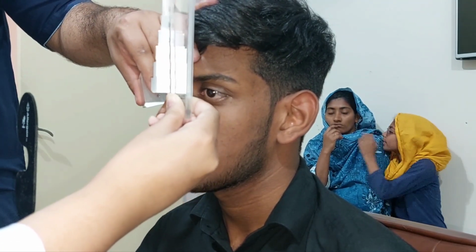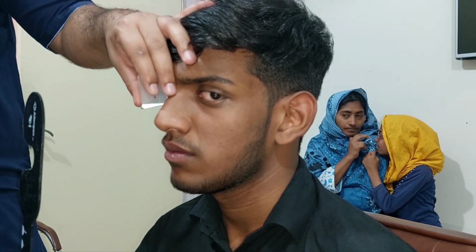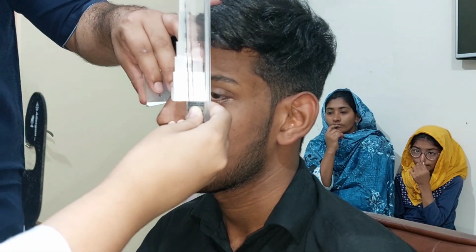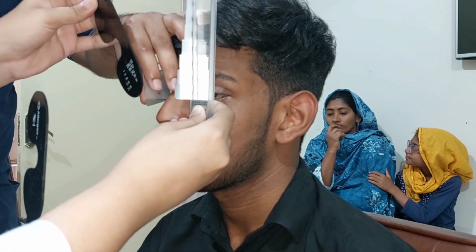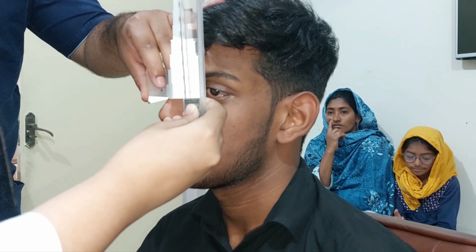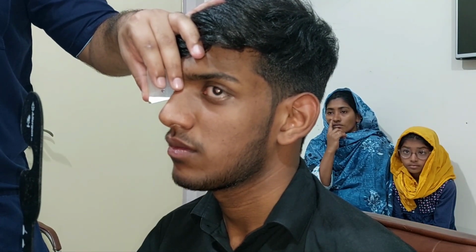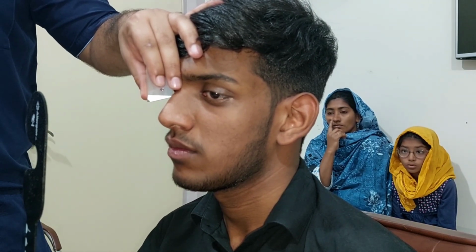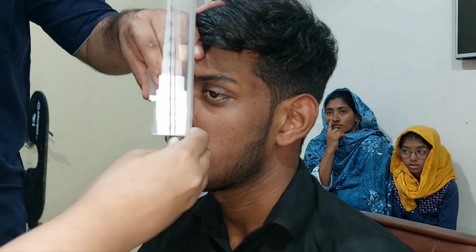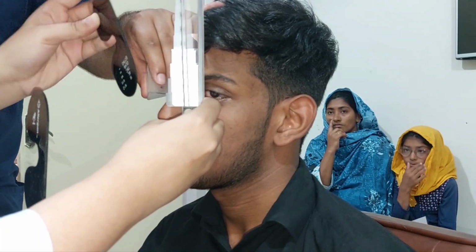And we shift the cover from one eye to the other and keep the cover for 2-3 seconds so that the fusion is broken and the eye is sort of independent from the other. The brain stops fusing the two eyes. You repeat the cover a few times and see where the movement stops. So that is the angle of the squint.